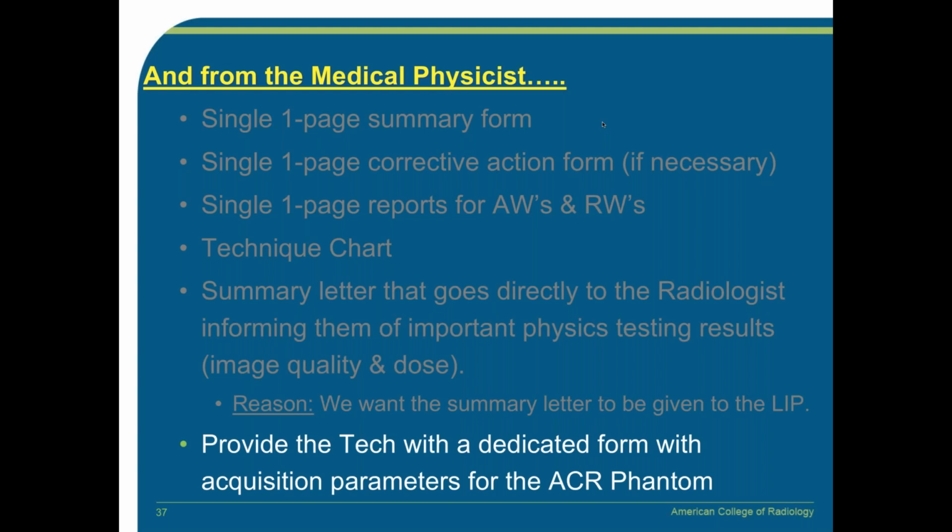We also can provide the tech with a dedicated form with acquisition parameters for the ACR Phantom. So there's some things that will come from the physicist that will help the tech start with their QC, like does their acquisition monitor have a test pattern? How should we acquire the Phantom in 2D mode? How should we acquire the Phantom in 3D mode? So the physicist now will be giving you these forms and making it easier for you to do your imaging and your QC. So let's move on.